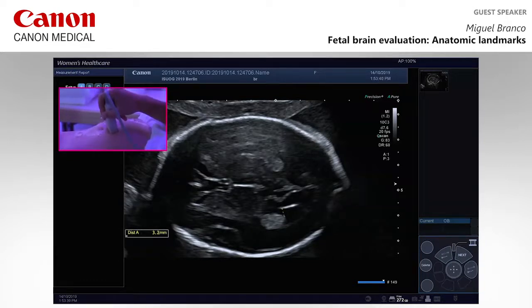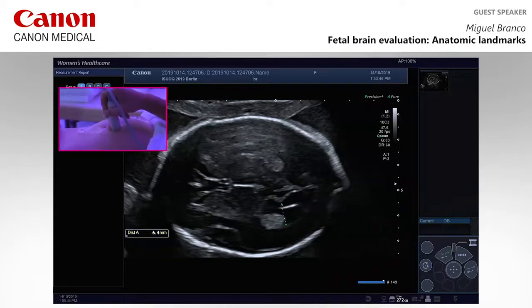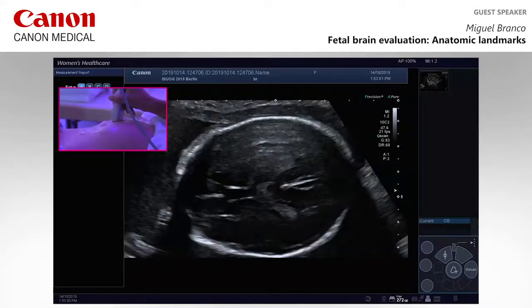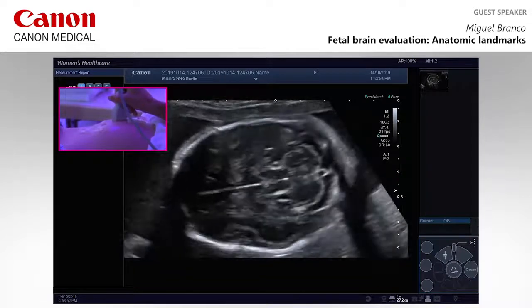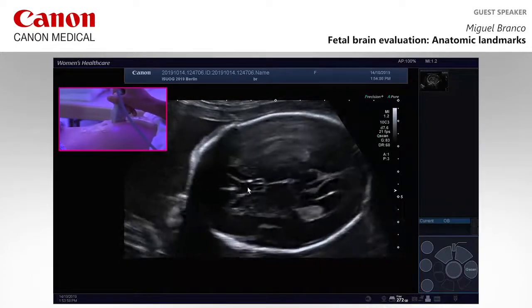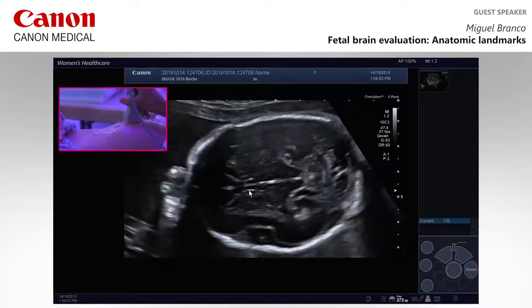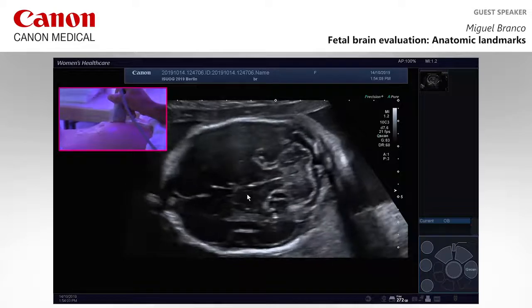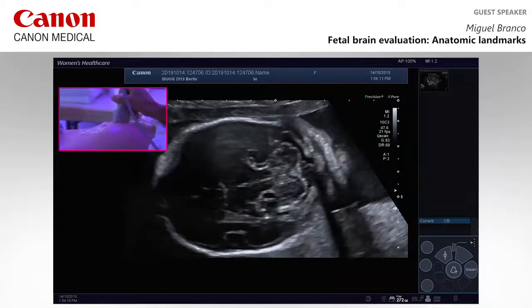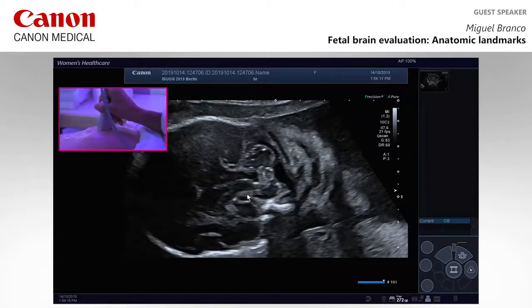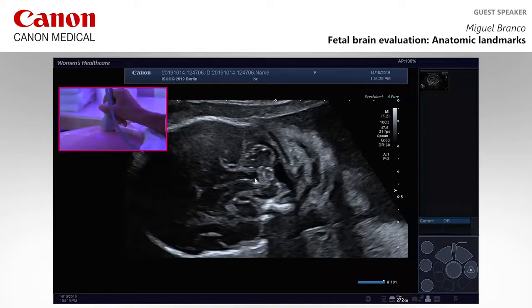You take the inner aspect of it and take the measurement without including the walls. To evaluate the posterior fossa, we also use the cavum as an anterior landmark and rotate slightly posteriorly. Here we are able to identify the vermis and the fourth ventricle, which should be shorter and wider as Laurent Guibaud described it.